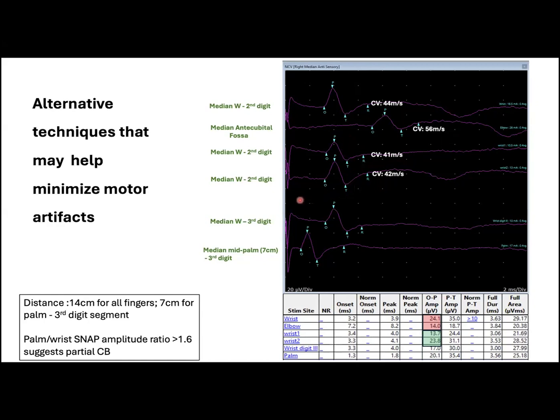In the last two tracings, we can see the comparison of two sides over the same median nerve, now recording from the third digit and stimulating at the wrist, then at the palm.